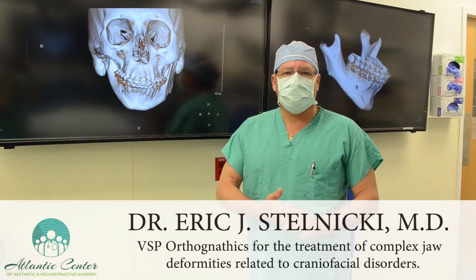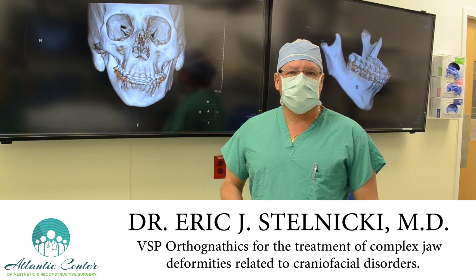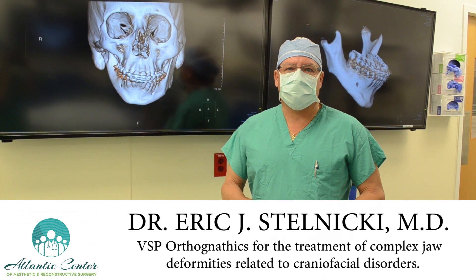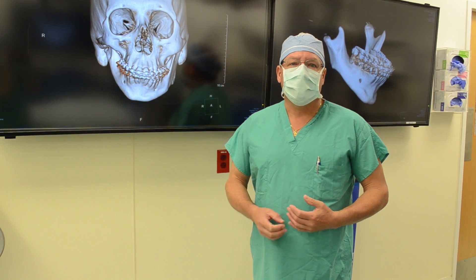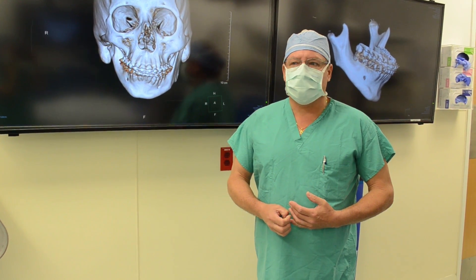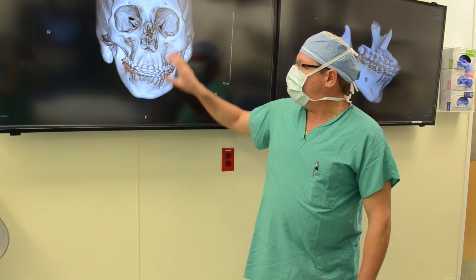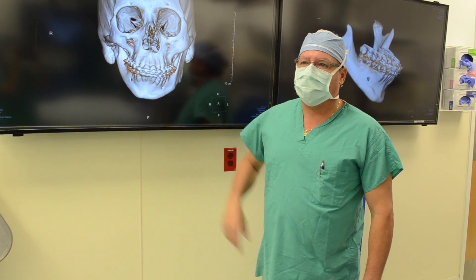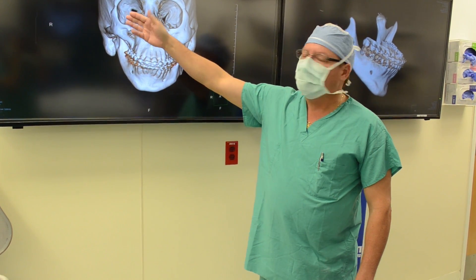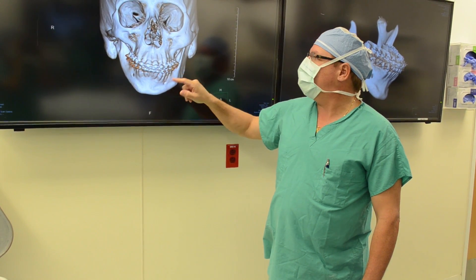Today we're going to be doing a virtual surgical plan jaw surgery of the upper and lower jaw on a patient with craniofacial microsomia. This is only the second surgery in the state of Florida of this type. It's a very unique operation in that we're using computer planning and computer modeling to reshape the face of this patient, who was born with a birth defect called craniofacial microsomia, where half the face doesn't develop as well as the other half.